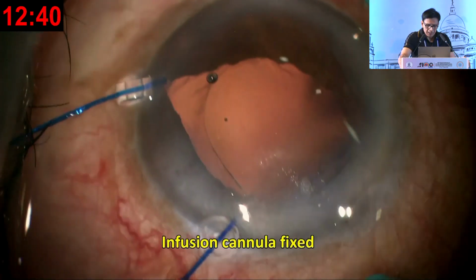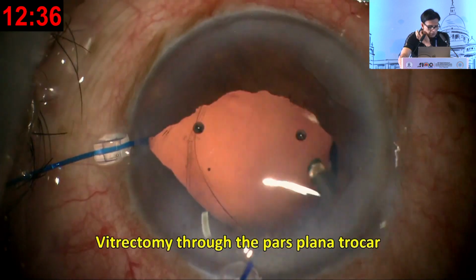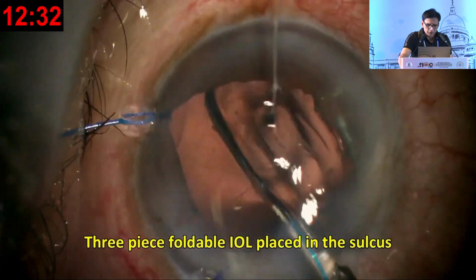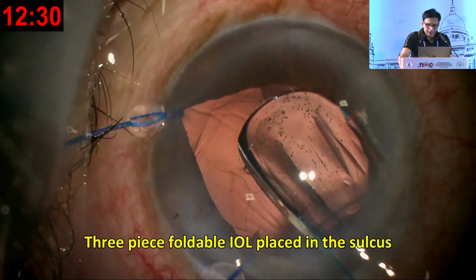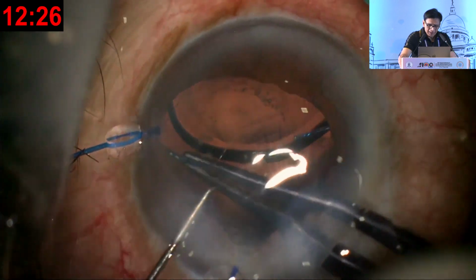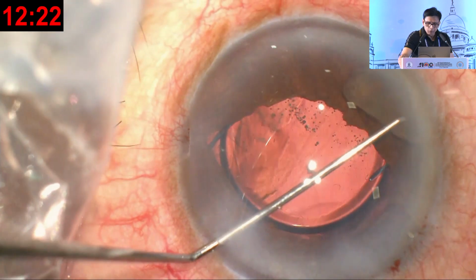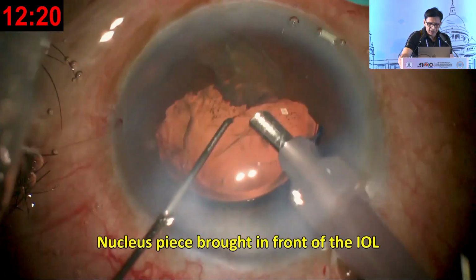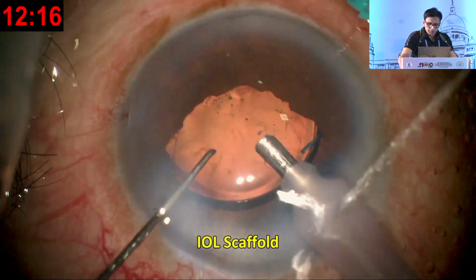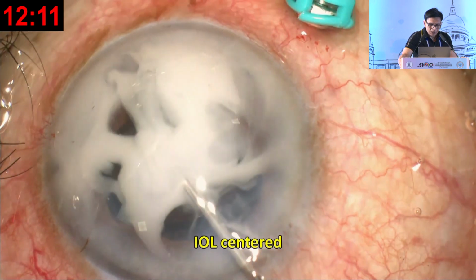Now you notice I'm fixing my second infusion trocar there for vitrectomy, and I'm doing my vitrectomy through that. Now I take my 3-piece lens and I'm implanting it in the sulcus. Once my lens is in the sulcus, now look at that nucleus. I'm going to bring that nucleus anteriorly above the IOL, use it as a scaffold and remove it. So far so good. Now the IOL is centered.